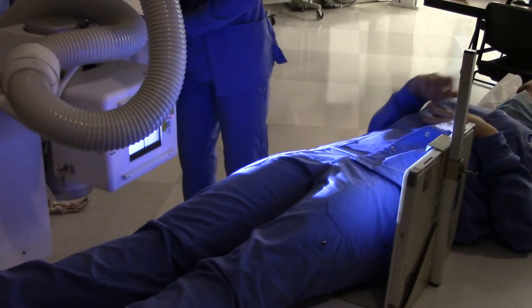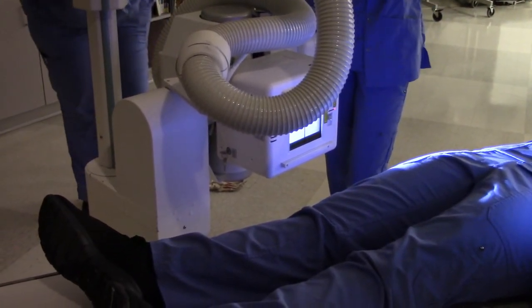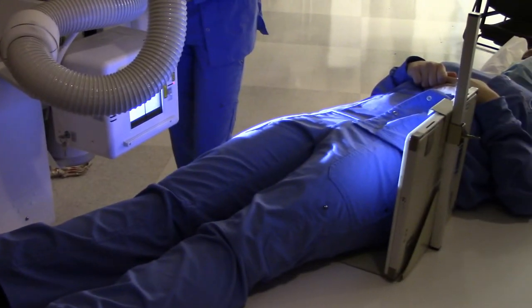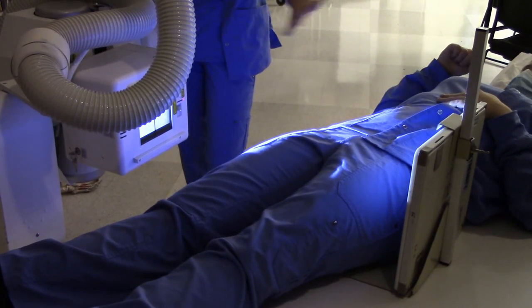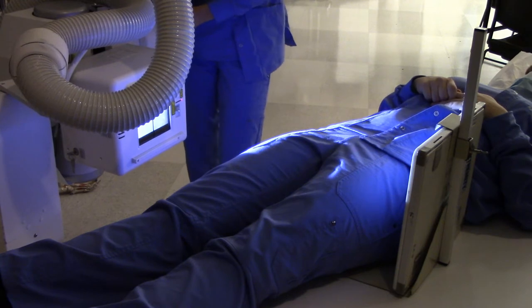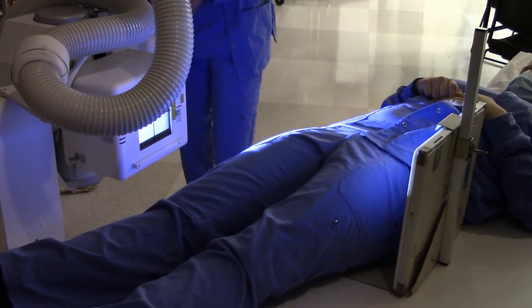I noticed that Miss Hope has pivoted the tube around so that the tube is between the crane and the table. How come you did that? To make it parallel, and so you could get it closer to the table. Very good. The reason why is your table is not up — because we have a hard enough time getting the right SID as it is.